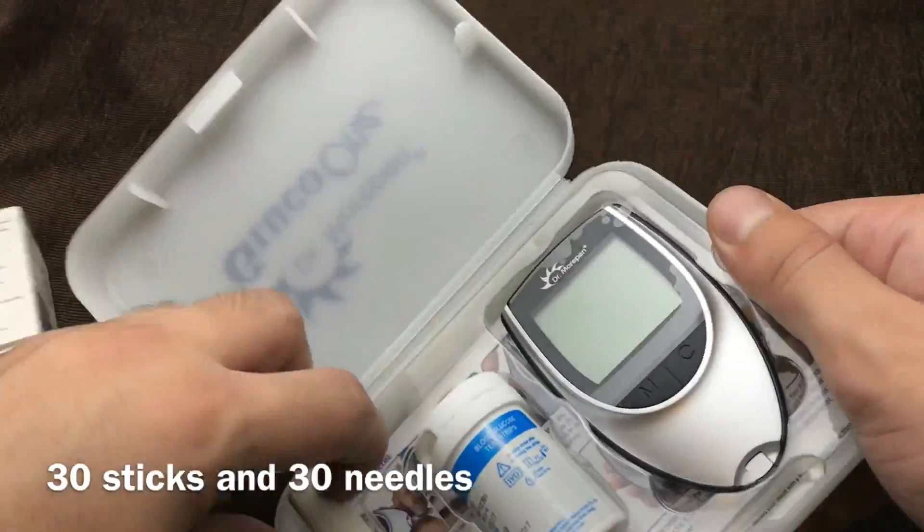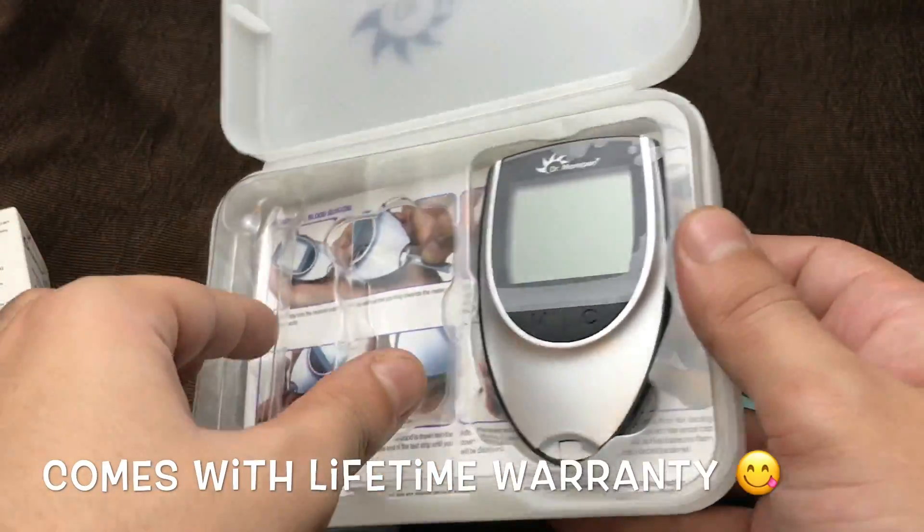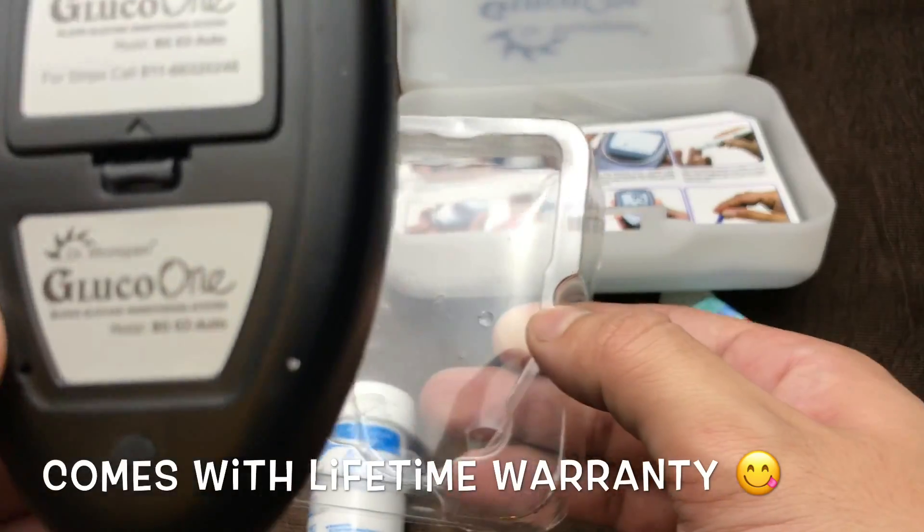This is a pen you can use for a blood sample, and these are some sticks, and this is the machine.